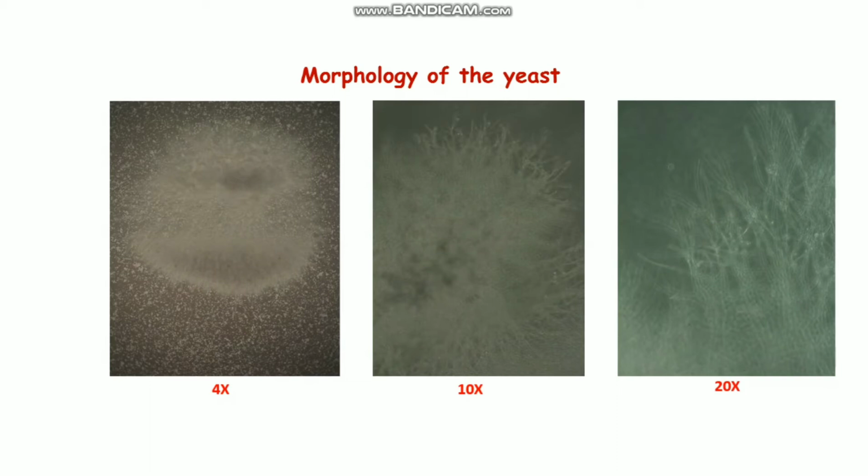If you can detect it at the initial level, there is a chance of not contaminating the other cells. But once the cells are yeast contaminated, there is a higher chance of the other cells in the incubator getting contaminated. So be very careful about it.